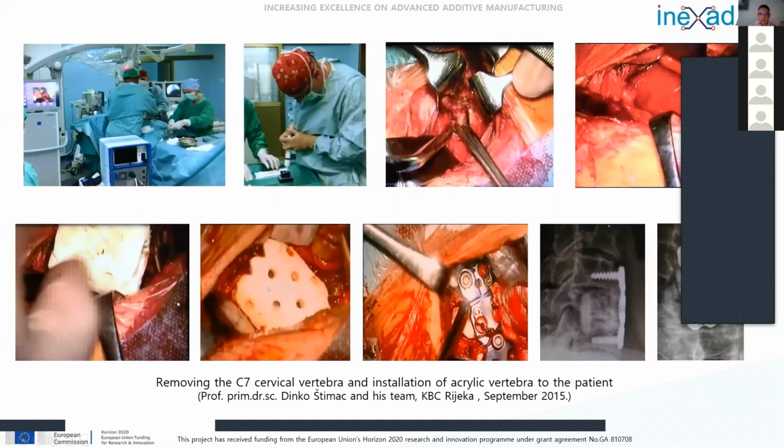So here maybe one remark: you also have the opportunity to use titanium nets for this type of surgery, but they are not tailor-made. So the surgeon has to adjust them to the patient. And sometimes it can happen that the surgeon will injure himself with this net.